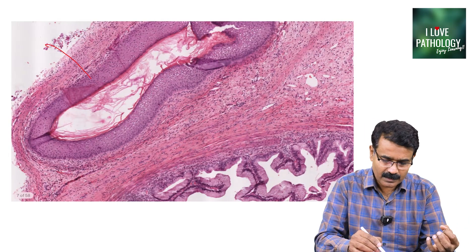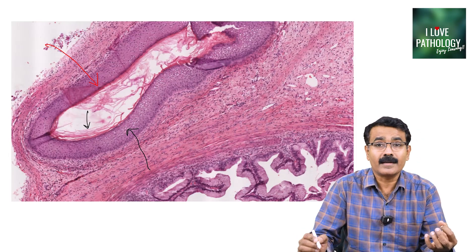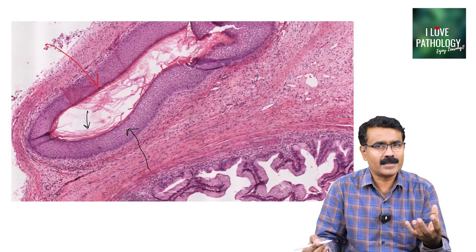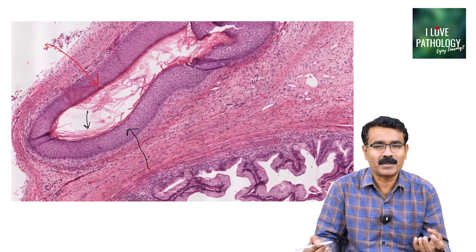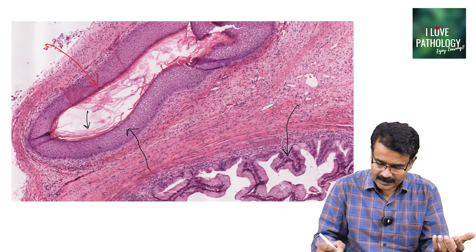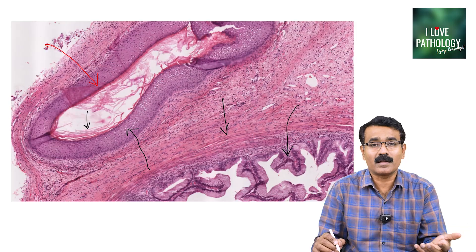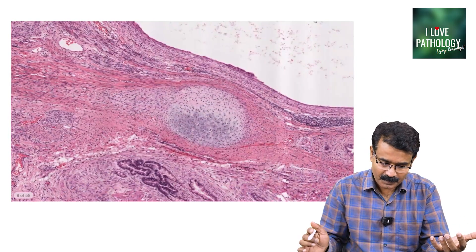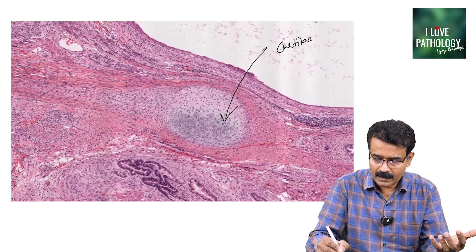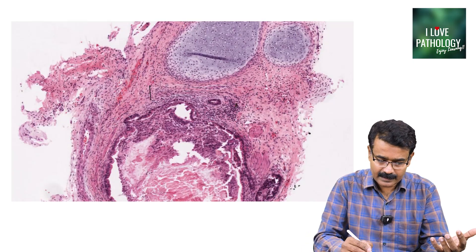Let us see how it looks in the histopathology slide. This is your stratified squamous epithelium. You can find keratin debris in the lumen of the cyst — that is why the cyst content is usually pultaceous, containing sebum and keratinous debris. Beneath that is glandular epithelium, and in between are spindle cells — the stromal or mesodermal elements. That is the cartilage element, and this is the glandular element.